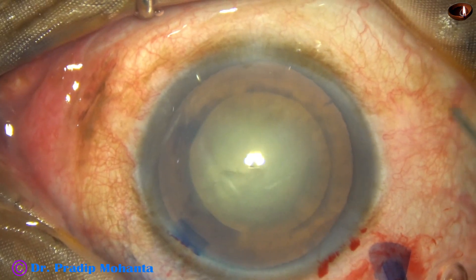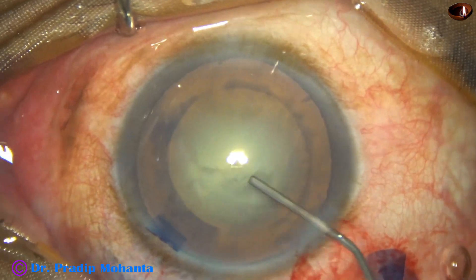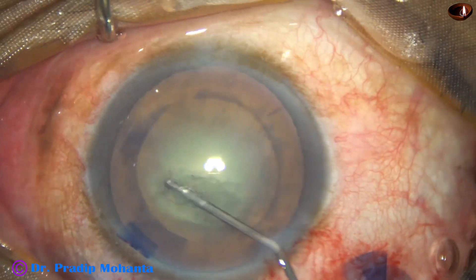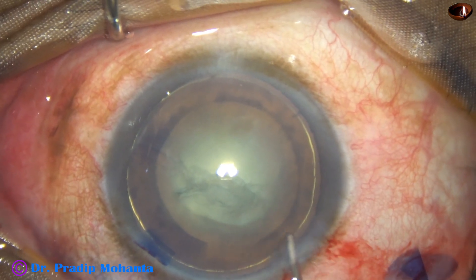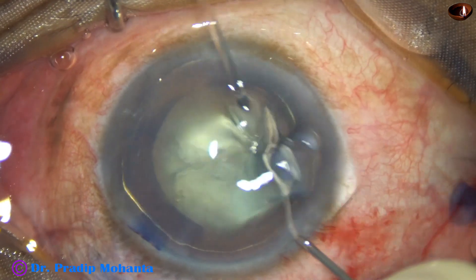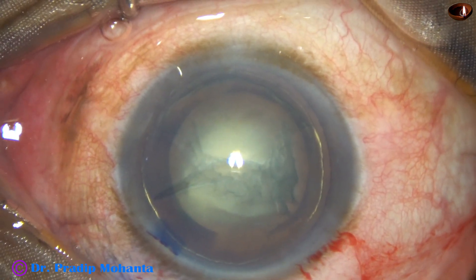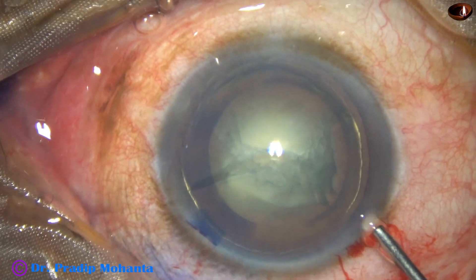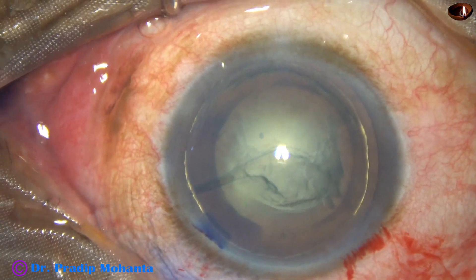Hydrodissection will not be done. Instead, I am going into the substance of the nuclear lens matter and injecting — this is a hydro delineation ring. Hydro delineation is done at another place, and the nucleus is not rotated.